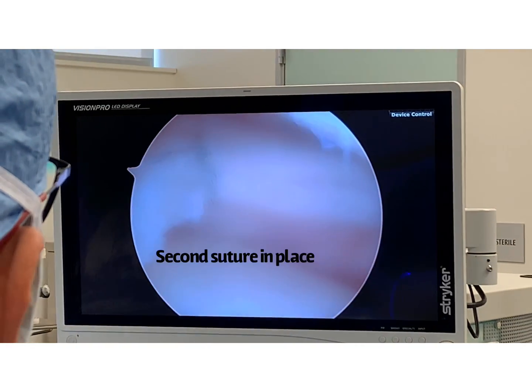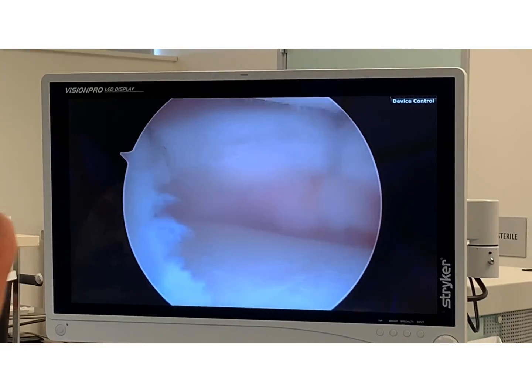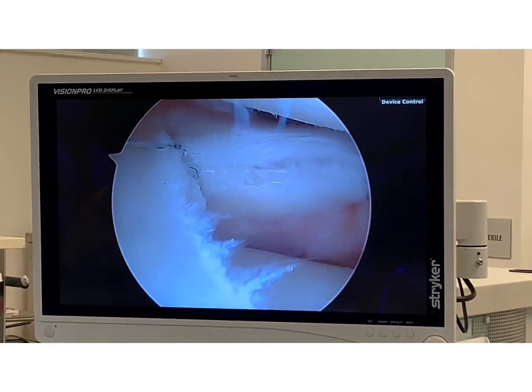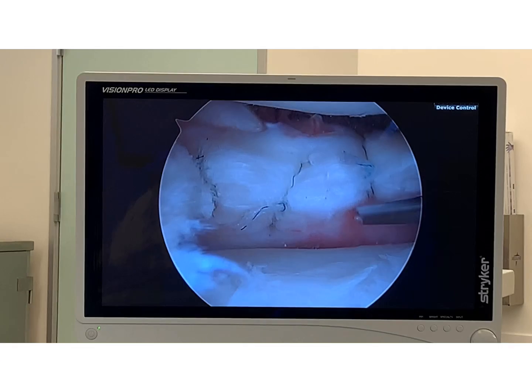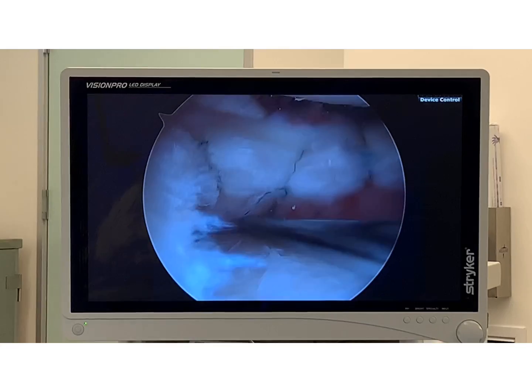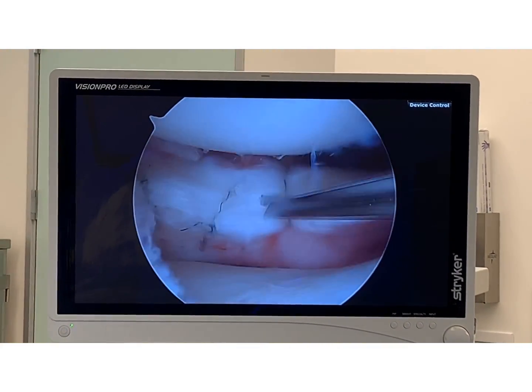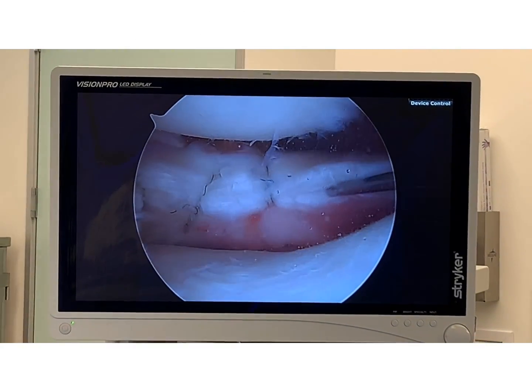Our second suture is in. We're already closing it down. The first suture is over there and the second suture right there. We're going to do one more and then that'll be it. There's the final repair — closing down the cleavage tear. Prior to closing, I created some vascular channels with the needle, and I'm going to add a couple more here just to create some bleeding. If there's no blood, there's no heal. That's why it's important to prepare your meniscus before it's repaired — create a lot of bleeding, and that way it'll heal up.